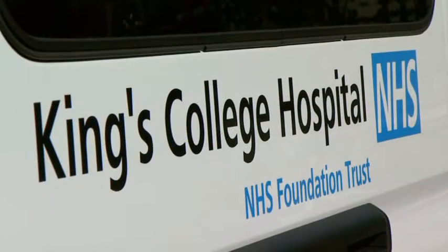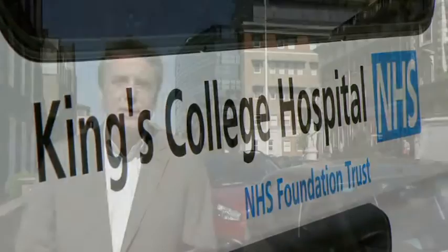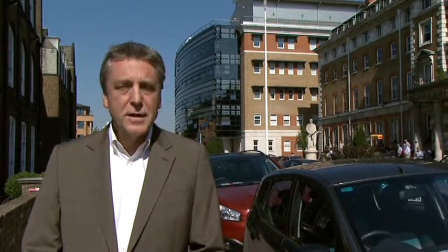We started our TAVI program back in 2007, and at that time the manufacturer asked us to use echocardiography during all our cases because, as they explained, at the beginning we need all the help that we can get. Well, now we're many hundreds of TAVI cases later, and we still use echocardiography during every single TAVI case that we perform. In addition, it plays an absolutely vital role in terms of patient selection and follow-up.